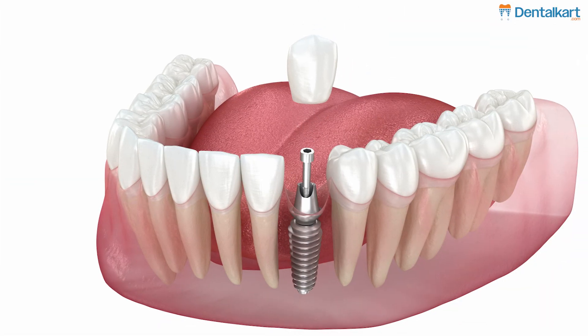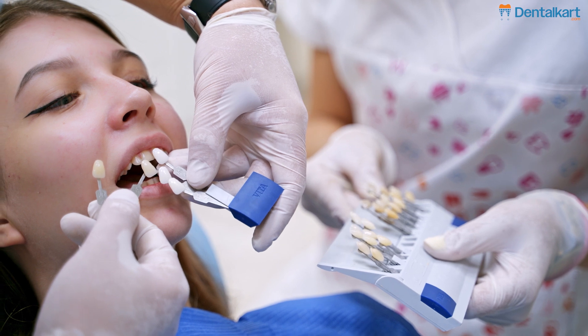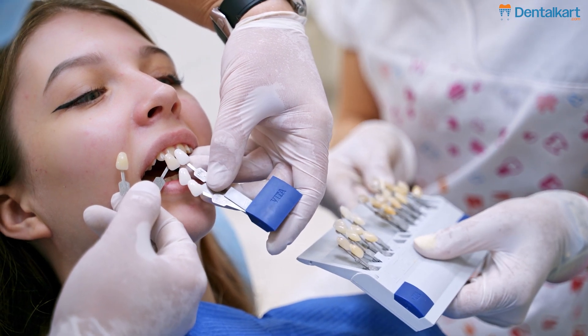Crown: the crown is the visible part of the restoration, custom-made to match the patient's natural teeth in shape, color and function for a seamless smile.